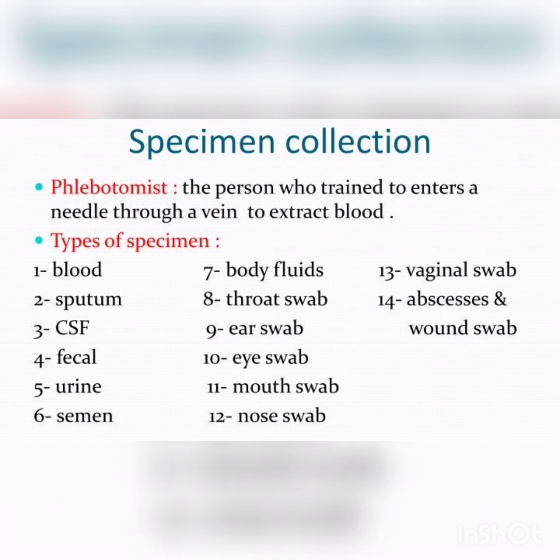So a calcium alginate or polyester tipped applicator will be there. There will be sticks. You need to collect the specimens. So, collection of material from the throat, nose, eyes, or ear, wound or operative site, or urogenital orifices and rectum.